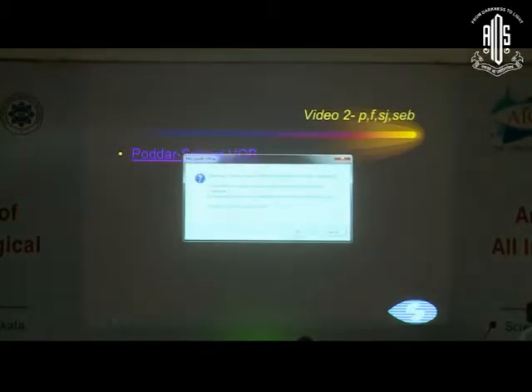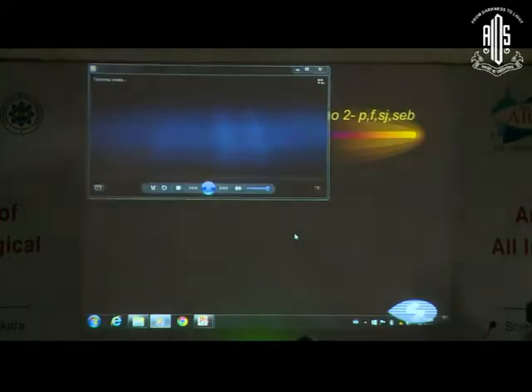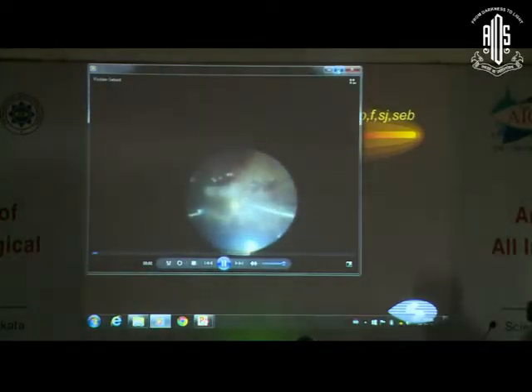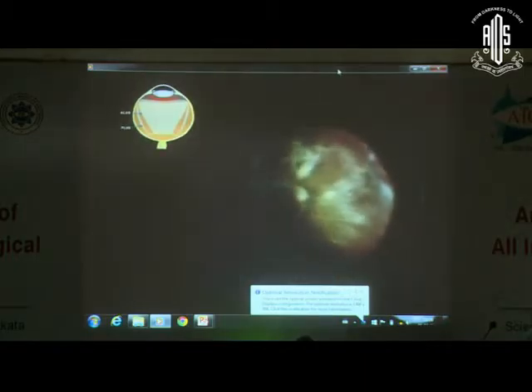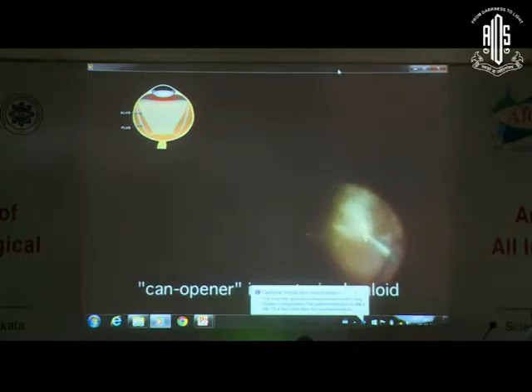So we'll just see a couple of videos now illustrating all these. To start with, sometimes the hyaloid is separated over the posterior pole, so you start from here, get an incision into that, and then gradually extend this along the temporal raphe. Once you've done that, then you can produce traction here both superiorly and inferiorly to separate the hyaloid all around, like 360 degrees circumferentially.